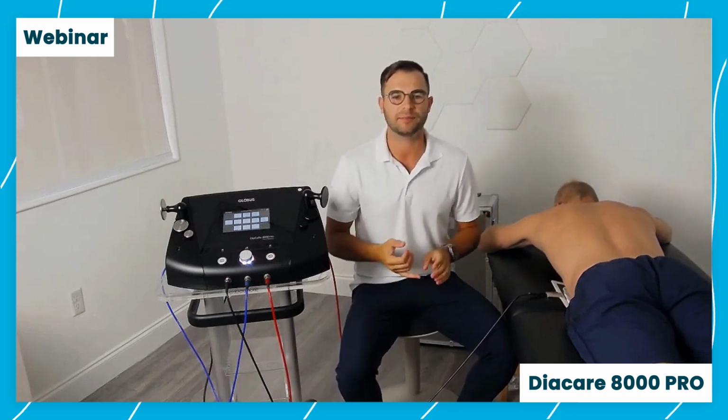So just a quick recap. We have our therapeutic effects. What is it increasing? Biostimulation, healing, tissue regeneration, while decreasing that inflammation that's building up, the edema, muscle tension, contractures, and joint stiffness. We need to know the difference between a capacitive and a resistive mode of transferring and using that electricity. The capacitive, we're going to be more superficial. Resistive, we're going to be a lot deeper into the tissues, okay?